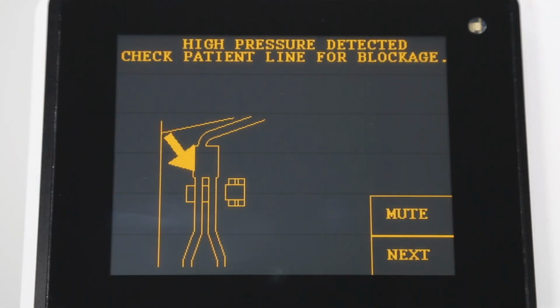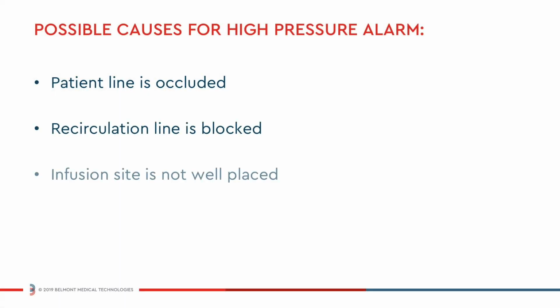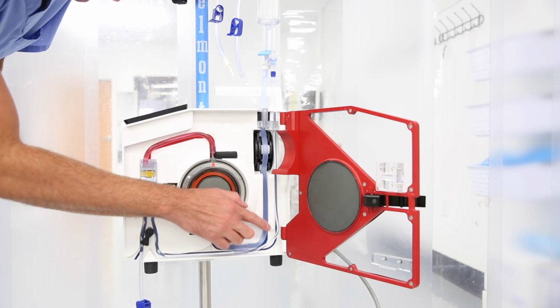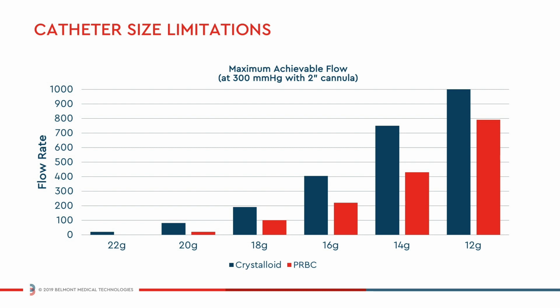A high pressure alarm will sound if the patient line is occluded, the recirculation line is blocked, or the infusion site is not well placed. In this situation, you should inspect the patient and recirculation lines to make sure that the flow path is not blocked. Check to see that the catheter is not too small or too long, and ensure all tubing between the Belmont RI-2 and the patient's catheter is able to support the selected infusion rate.